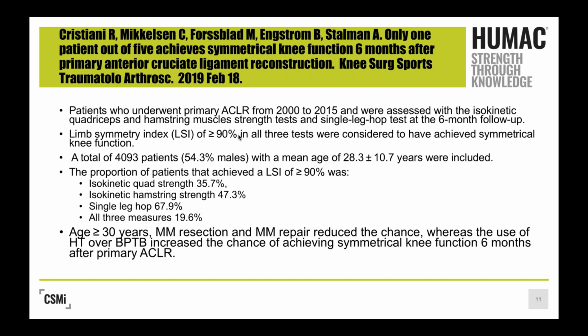So your patients can compensate for those weaknesses. They can cover it up during those functional tests. All right, a second thing to note is any meniscal involvement reduced their likelihood of symmetry. And they actually found that hamstring grafts did better than the patellar tendon grafts.